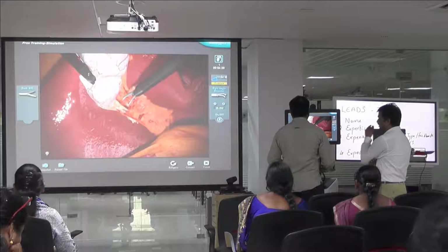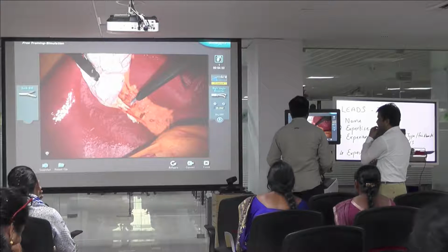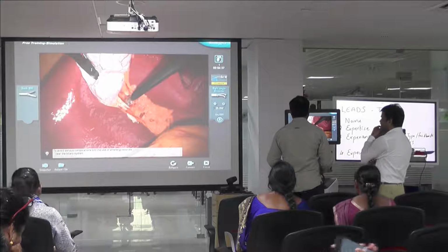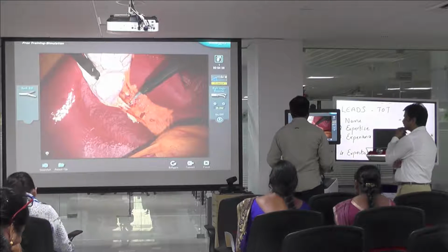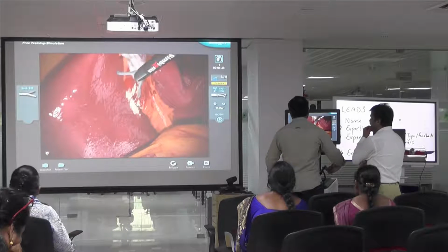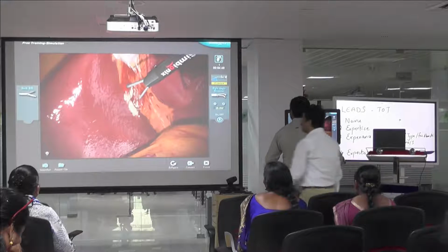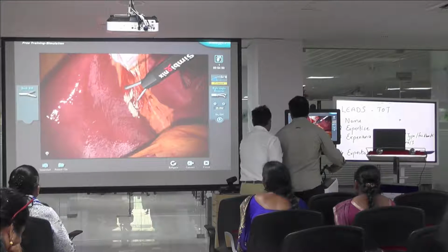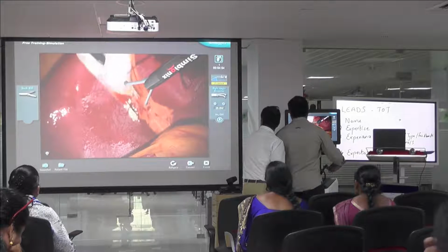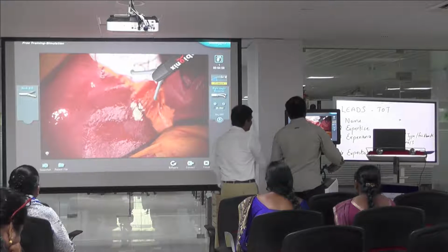Yes, we are seeing this side coming. This much pull to the one, but left hand should, yes. Just this one should be. You are holding, na. You are pushing out. Just this one. So go like this. You see now, like a pivot movement. It should go like an arc movement.